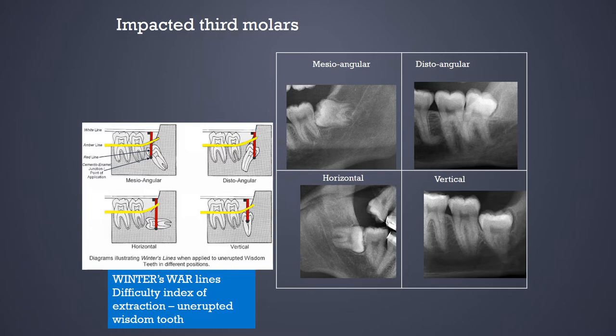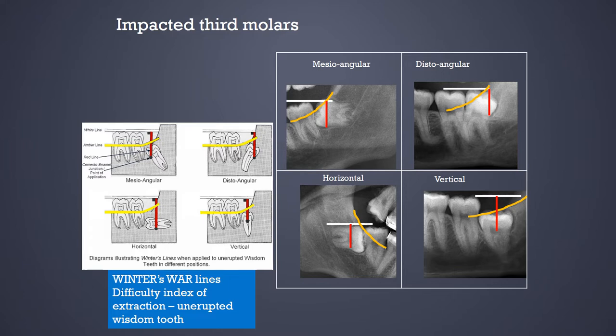For impacted third molars, panoramic radiography is a really important tool. You can see different cropped images from impacted third molar panoramic radiographs showing mesioangular, distoangular, horizontal, and vertical impactions. This is very useful in understanding Winter's lines — the white, amber, and red lines — to assess how difficult the extraction could be.